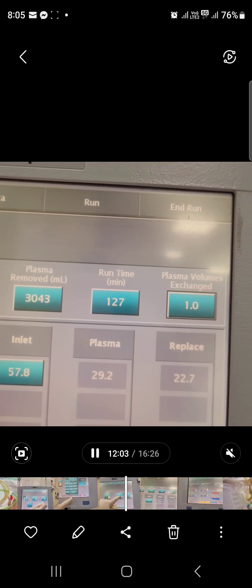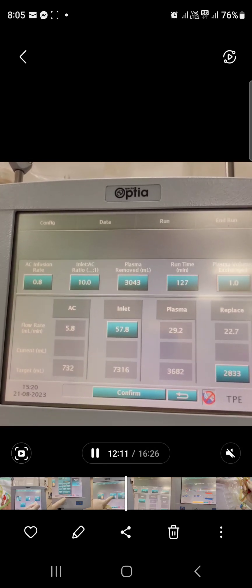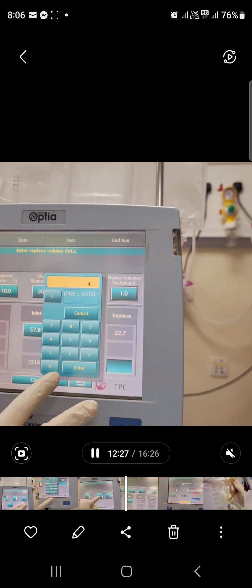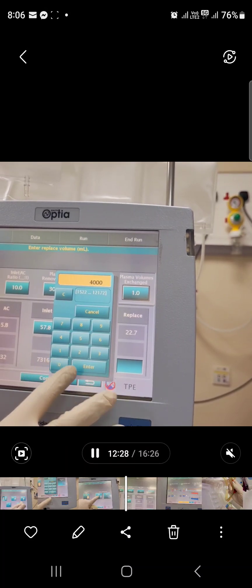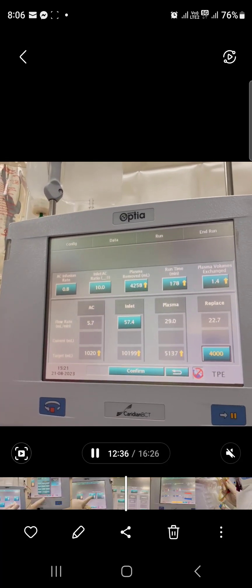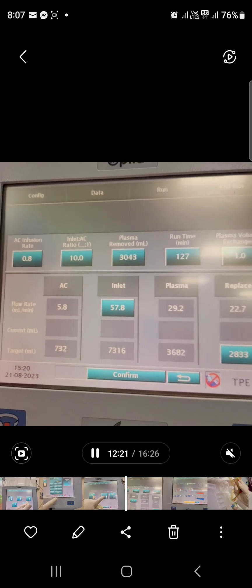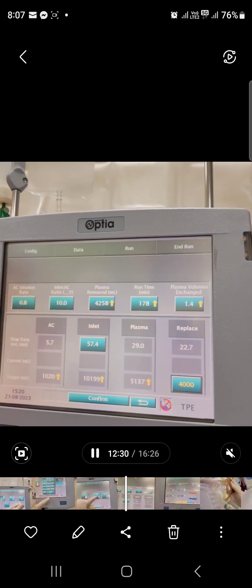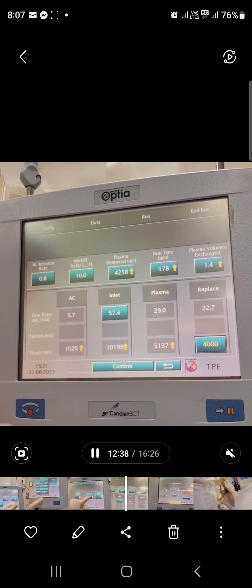There will be some details of information to review on the screen. For the plasma volume exchange, enter the doctor's ordered volume — in this case, the doctor's order is 4,000 ml. Once you put your plasma volume exchange figure here and enter the volume ordered by the doctor, the machine will automatically set up all the details. Press confirm.